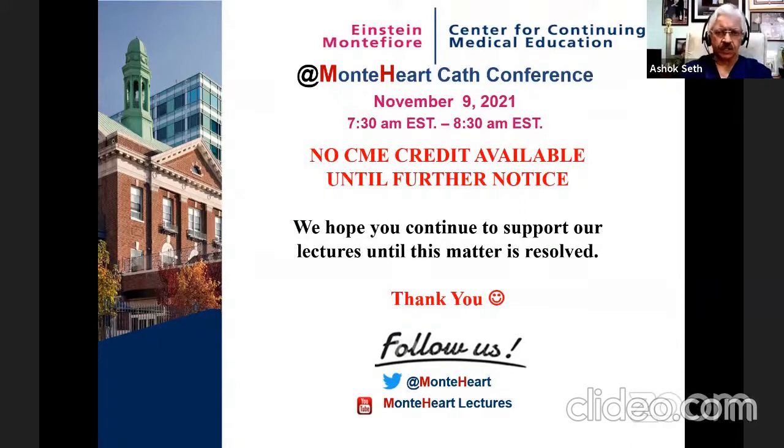And IVUS imaging is easy in these because, as you know, once you've intubated them and you've got a wire, and you've got what is a support wire, it's either a BMW or even a BHW, you can get imaging done. And therefore, I would certainly recommend that in most of these, because you don't want to come back into this. You want an optimal result, you want the least restenosis, and you don't want stent thrombosis, because these are not pleasant to chase and get back into. Certainly recommend imaging and sizing and optimizing based on imaging.